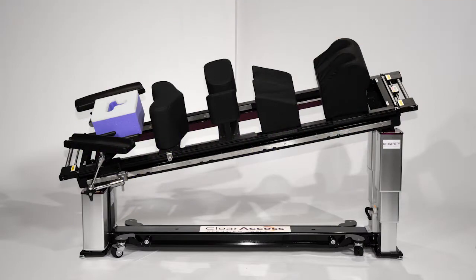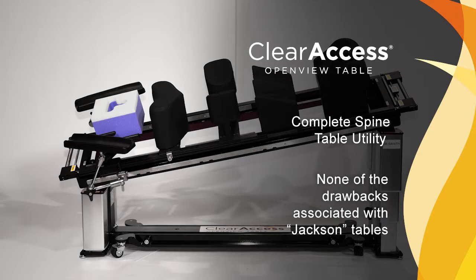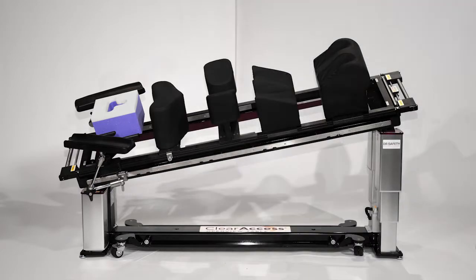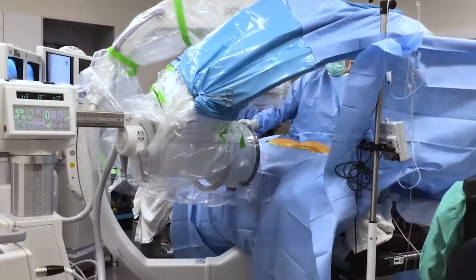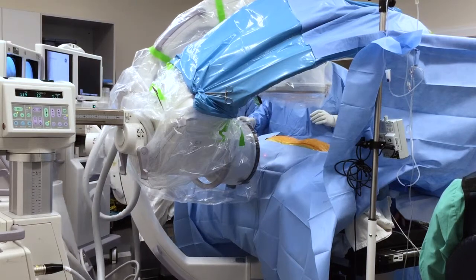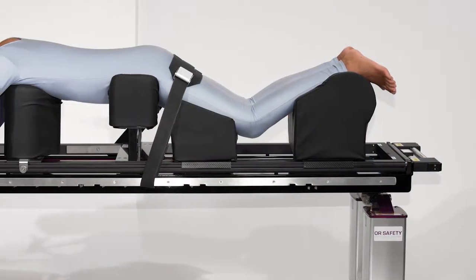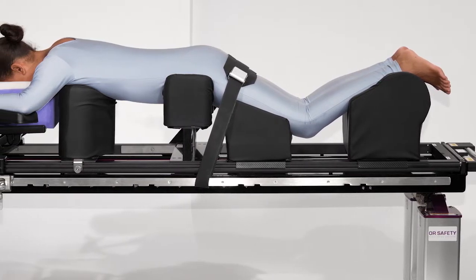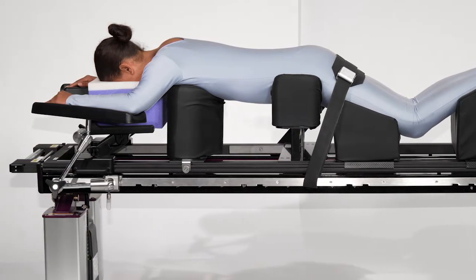The ClearAccess spine surgery table by OR Safety was developed to maintain all of the utility of competitive spine tables that are generically referred to as Jackson tables, while removing all of the notable drawbacks of those types of systems. The table maintains head-to-toe C-arm access for lateral, anterior, and posterior spine procedures and can support the simultaneous use of two C-arms. While maintaining such unrestricted C-arm access and providing target site radiolucency, the ClearAccess table has a safe working load of 600 pounds and has a noticeably more stable operating surface, particularly for heavier patients.